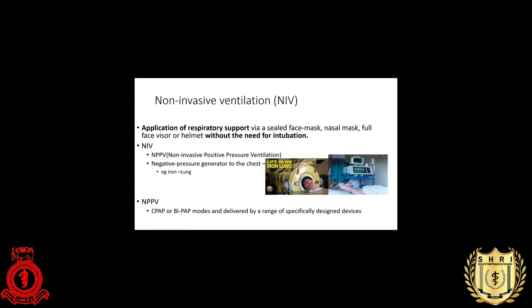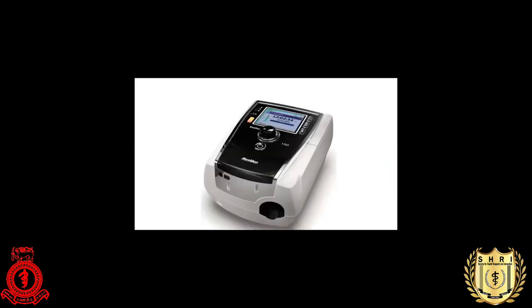Now we commonly use CPAP and BiPAP as non-invasive positive pressure ventilation. This is a respiratory machine. It's very commonly used in the emergency department and high dependency care unit. It's small compared with your conventional ventilator and easy to use, and I think it's cheaper than that.